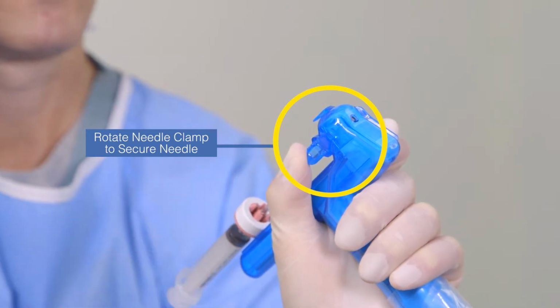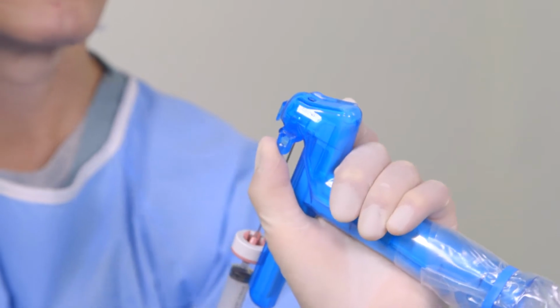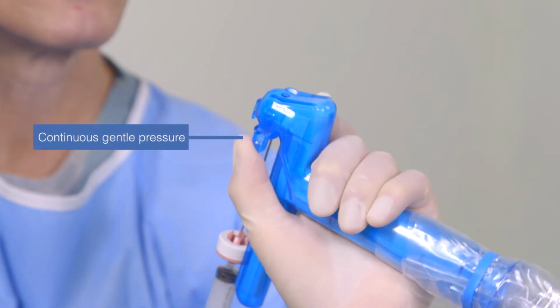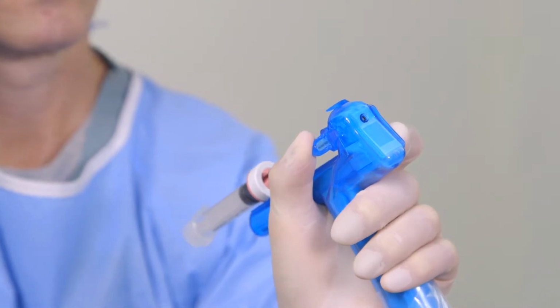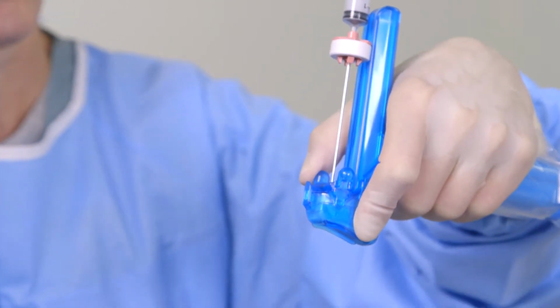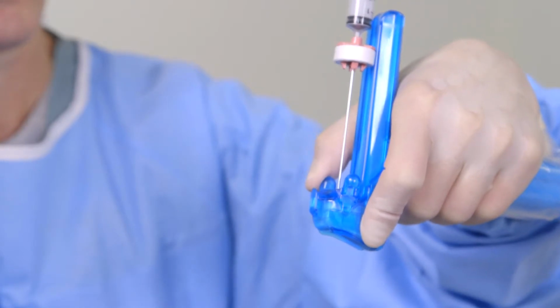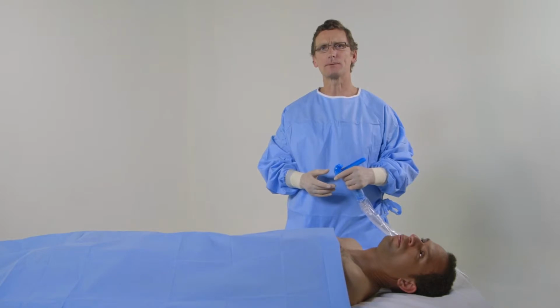Check to be sure that the needle tip is not protruding from the bottom of the sterile shield. Hold continuous, gentle pressure on the needle clamp to maintain the needle in its safe, retracted position during patient scanning and until you are ready to advance the needle toward its target. Now I will show on our model an example of how I perform a subclavian central line using AxoTrack.